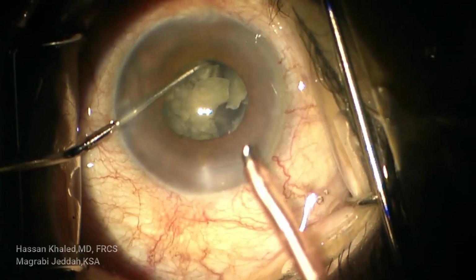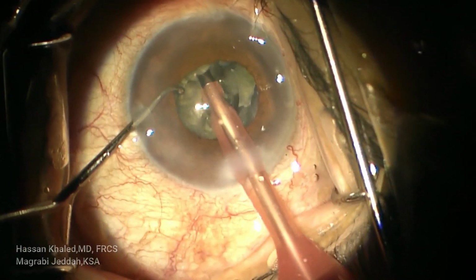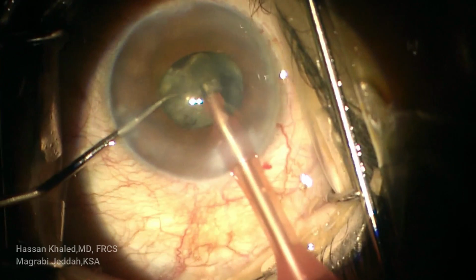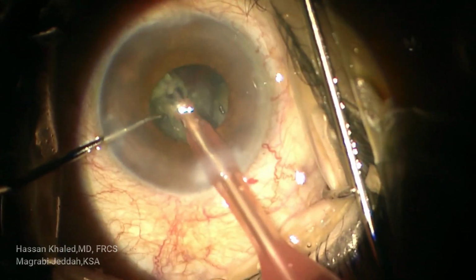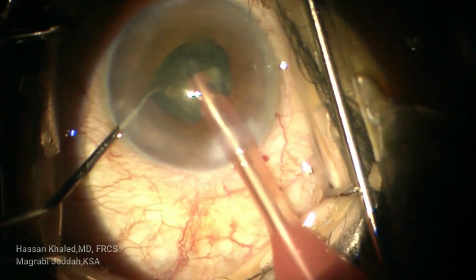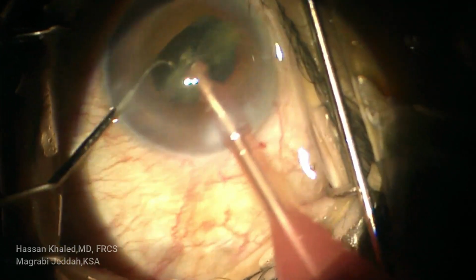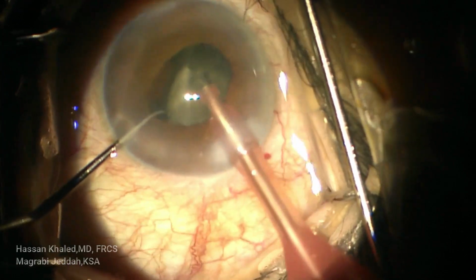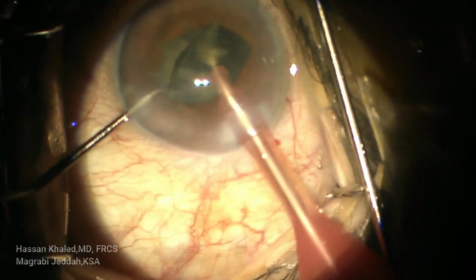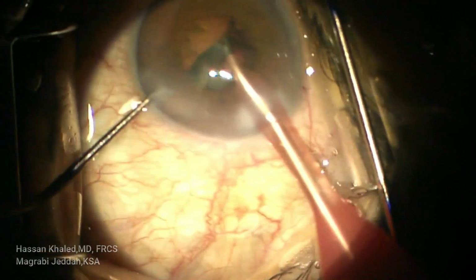Now after chopping the nucleus with the sharp pointed chopper, you can change to another, safer chopper with a blunt end. You can see here my chopper, there is a ball at the end of this chopper. You can continue emulsifying these pieces. Hold each piece and lift it up at the level of the pupil and emulsify just supranuclear, which is a safe place for emulsification as it is away from the endothelium of the cornea and from the posterior capsule.